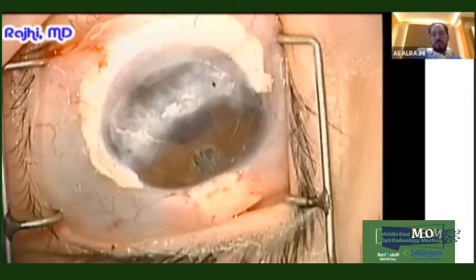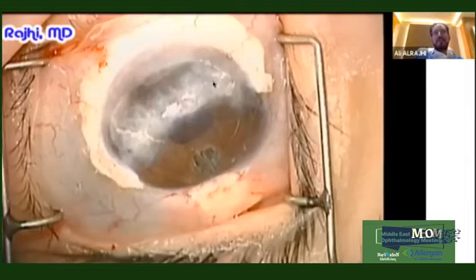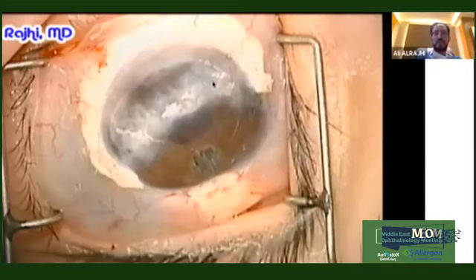I have one case of this, and this was reported. In another case, sometimes they have difficulty in having the epithelium healed over the central cornea. But as Dr. Vogler mentioned, this is one of the approaches to strengthen the cornea, epikeratoplasty from limbus to limbus.